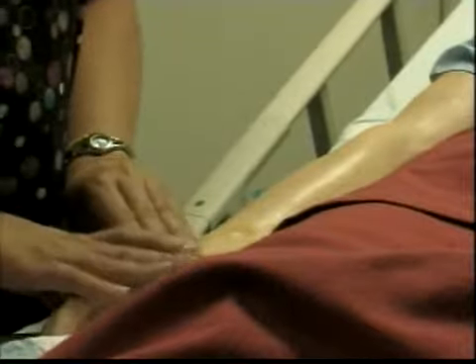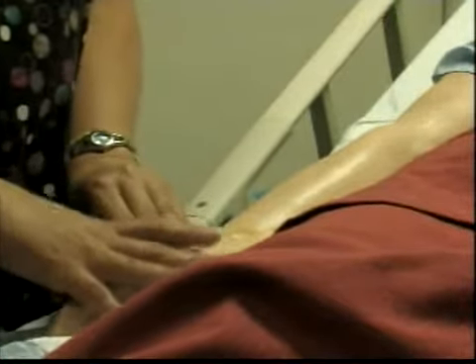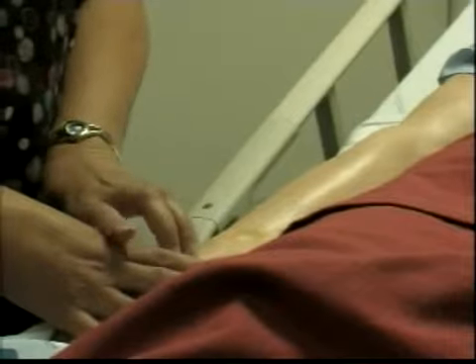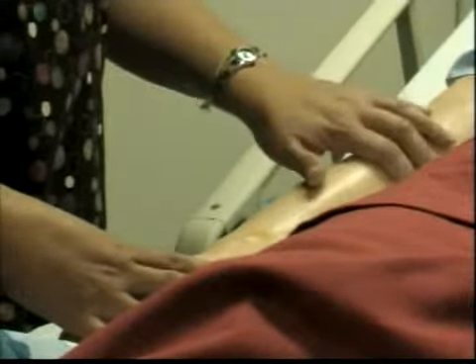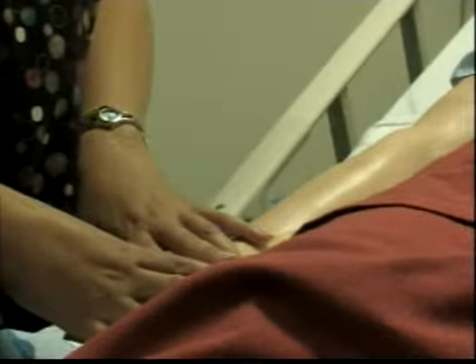You want to start from distal to proximal, because if your IV site infiltrates on the hand, then this is going to need to be rested, and you want to put either hot compresses or cold compresses. Then you can actually use the same vein but a little bit higher because it's not going to disturb what has already infiltrated. So you'll have the ability to move up and still maintain the integrity of the IV and prevent any more complications on your client.